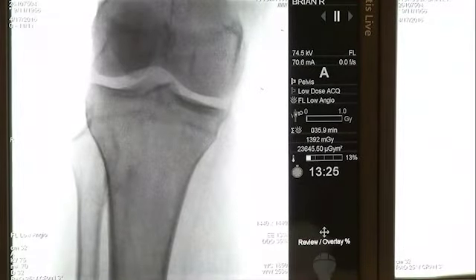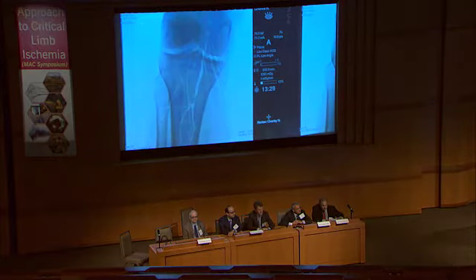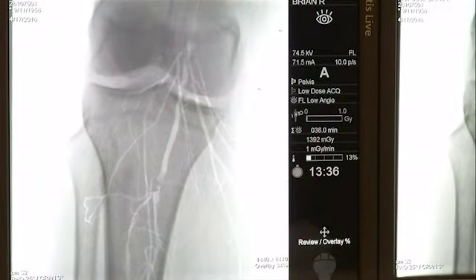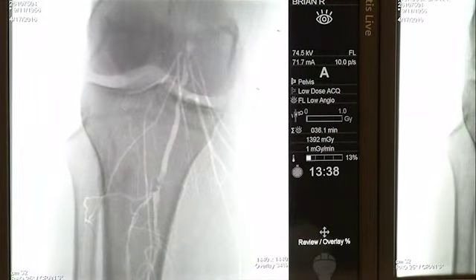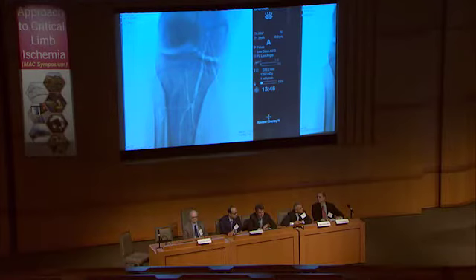Mehdi, I think this is the easy part compared to what you've done. This is a remarkable case. You've done a great job getting to this point. Yeah, very nice. I think it's also very important that you re-entered here right into the open artery at the genicular area. Otherwise, if you would have dissected further down, you might have lost these genicular collaterals.